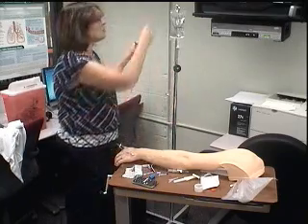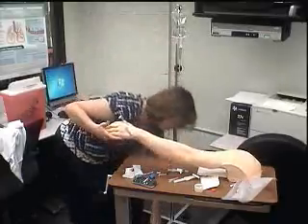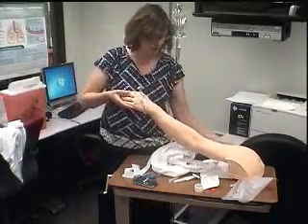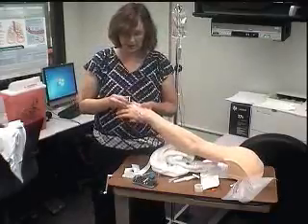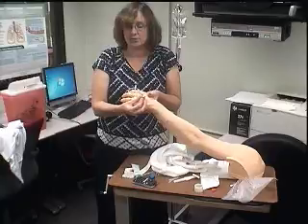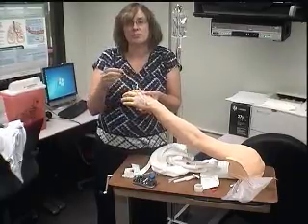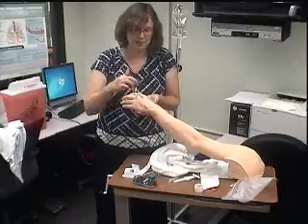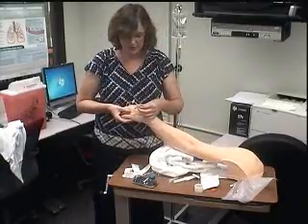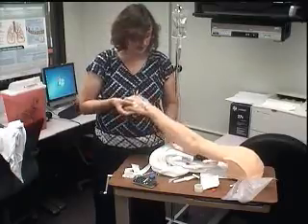With a saline lock, you won't have the blood backing up. If you just did it for a regular IV, you might have fluid backing up if you held the IV lower or anything like that. With a saline lock, if you don't want any blood to back up, you've got this positive pressure, but also this little clamp will clamp it so it helps to create a positive pressure so the blood doesn't back in. Okay, so both kind of things help. This little saline lock itself helps to prevent that blood from backing up, so does this little clamp.